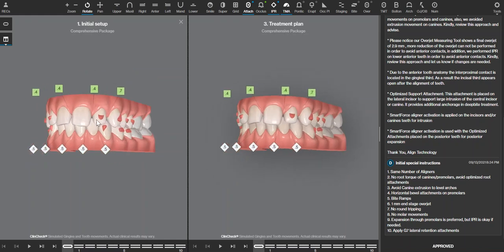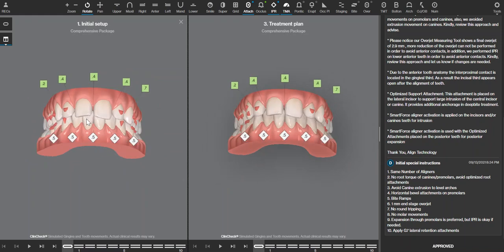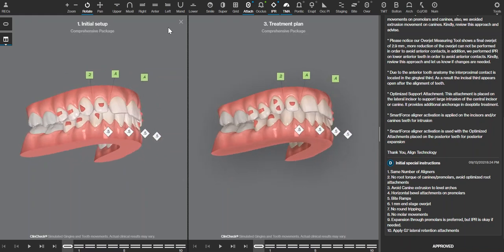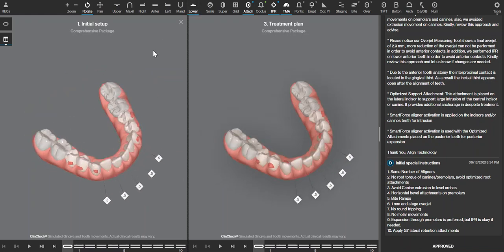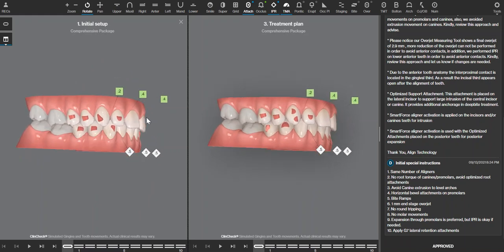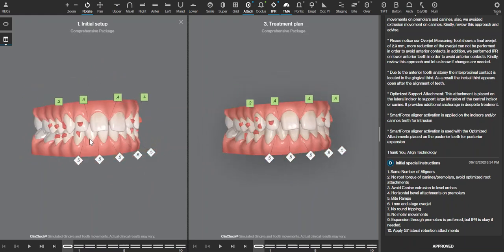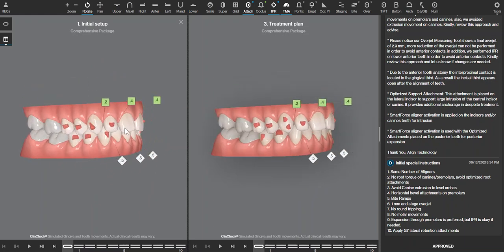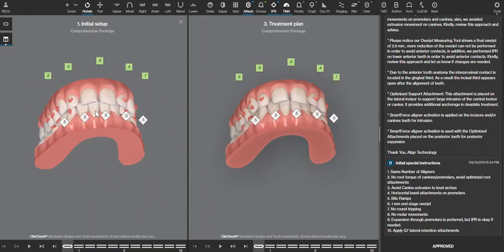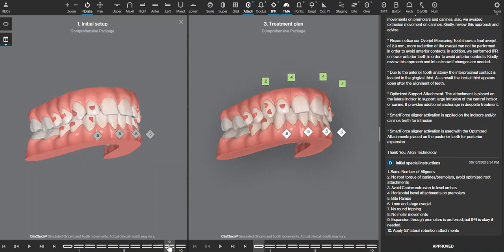Hi doctors, this is a spacing case with some degree of difficulty. So this has upper spaces and lower crowding. So these are arches that don't fit together very well, and the patient wants all of these anterior spaces closed. So one good thing that we have for predictability is we do have the correct retention attachments, and we have bite ramps on the anterior and some lower IPR.